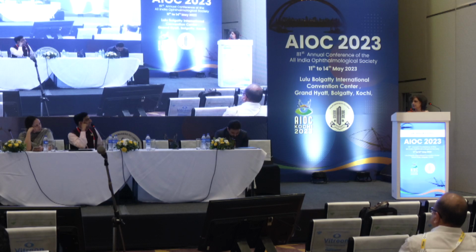No, see, as it is, the blood forms a kind of tamponade over the break, but that's not lasting. The glue probably just adds to it, and you have a tamponade for the time that you need. You have done laser, but you haven't been able to see the burns. So possibly you have some laser effect which you can supplement post-operatively as the blood resolves. But I didn't have to supplement the laser in these patients.